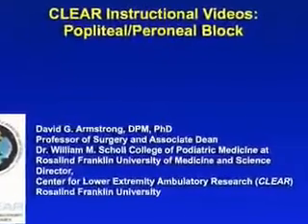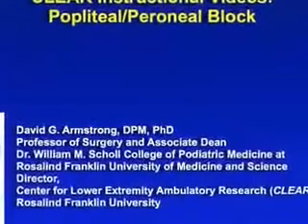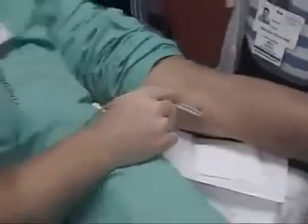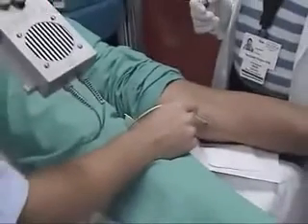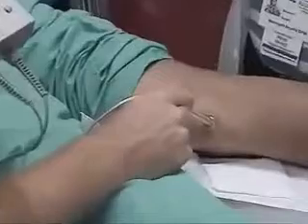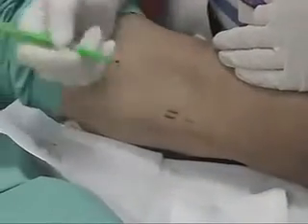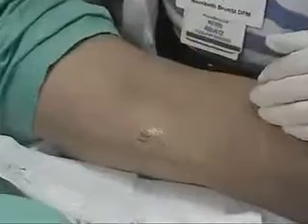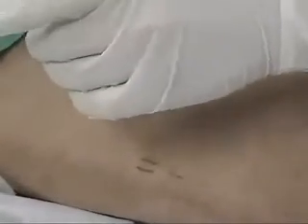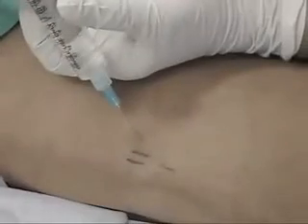In this brief video clip, we will discuss our technique for performing a popliteal and common peroneal nerve block. Initially, the patient is placed prone on a procedure table, and in the proximal medial aspect of the popliteal fossa, we palpate for the popliteal artery. This is done initially by palpation and subsequently with a Doppler probe. We then mark that area and subsequently instill our anesthesia just laterally to the popliteal artery.